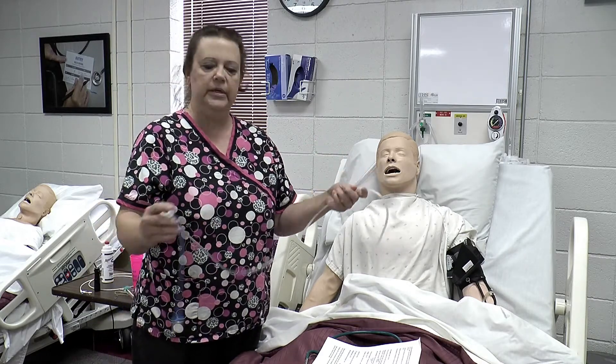Also, if he has a history of a skull fracture or nasal surgery, that would be somebody you wouldn't want to put it in unless you have some x-rays at the same time. Because there have been times when someone had a skull fracture from an auto accident and the tube went up into the brain — up instead of down. So if there is any trauma, do we want to get an x-ray first? Hint to the doctor. Ask him if he has past trauma with his nose, because if he has a broken nose the tube may not go down well. We're going to ask him which nostril he breathes better out of, and that's the one we're going to insert the tube through.